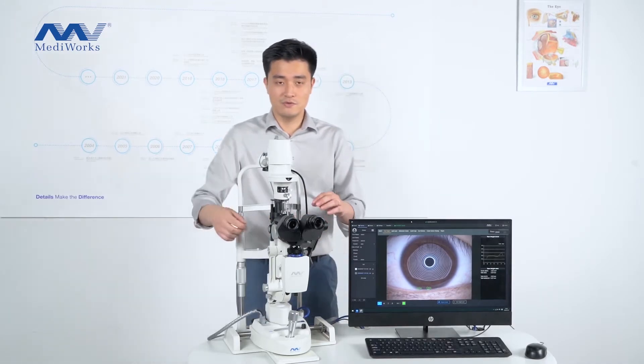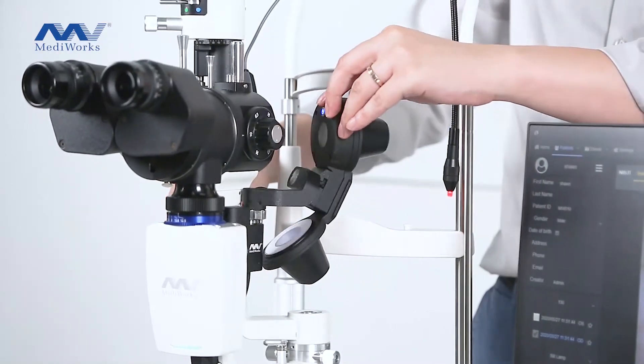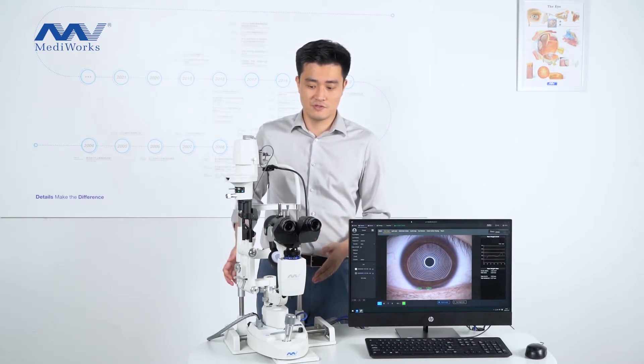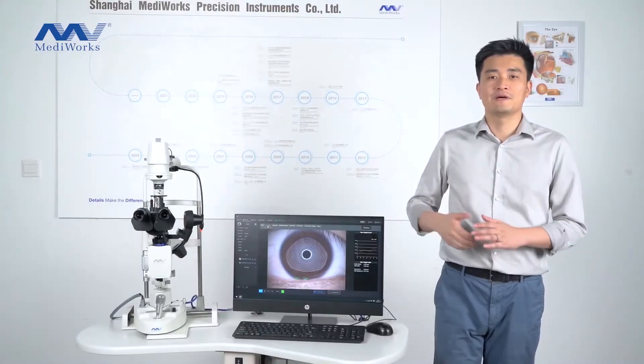When you want to use the dry module to do the dry examinations, you put it here. And when you want to use the slit lamp functions, you just move it aside.